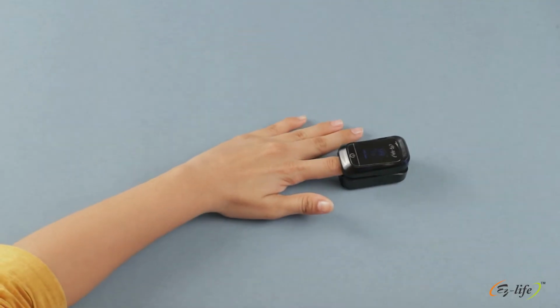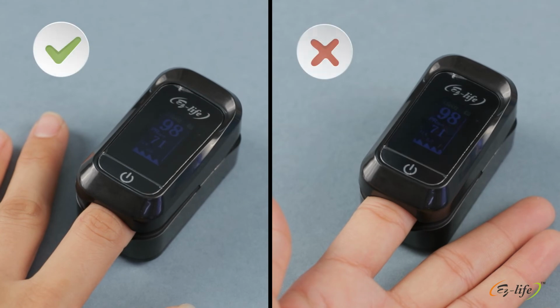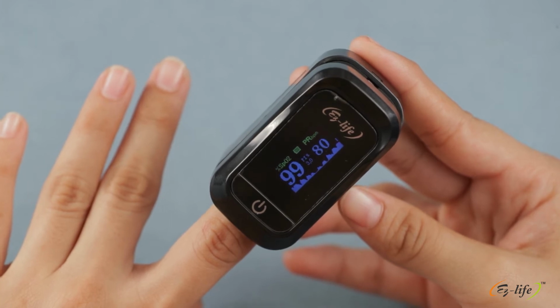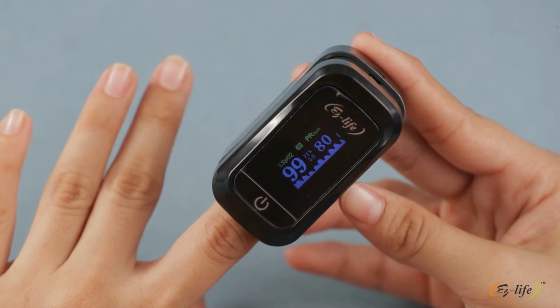Keep your hand very stable for a few seconds while your device is taking your reading. Please keep in mind to keep your nail upward and not otherwise. After a few seconds, your device will show your current blood oxygen and pulse rate reading.